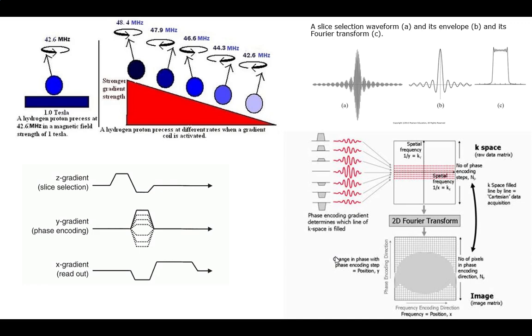Then I'm going to set the dephasing. That is literally setting, and I'm doing it spatially, but it's going to be a phase effect on them. So I can then read the K-space, the Fourier space, that is what I'm going to read out. Because they're all superimposed, the system is going to superimpose the spatial ones.